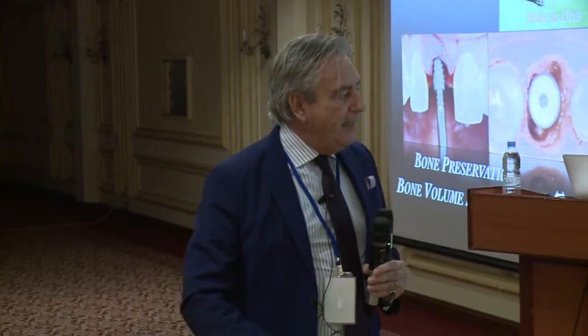But then we will have to manage this bone volume. And of course, the main important thing will be to preserve this bone. This is like gold. And this takes part of these MIS procedures. In conventional implantology, we have the solution, well known, well described in all these publications.